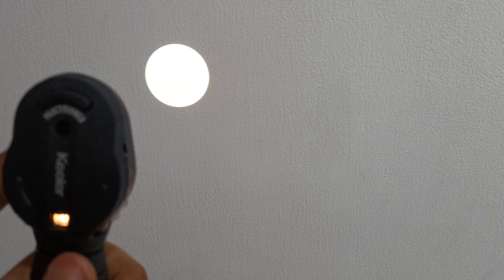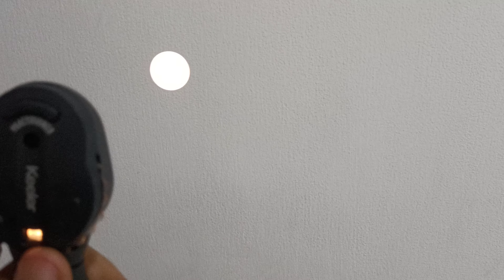Multiple apertures are available: wide angle, intermediate, macular, cross, fixation, slit, and cobalt blue filter. A green filter is also available.